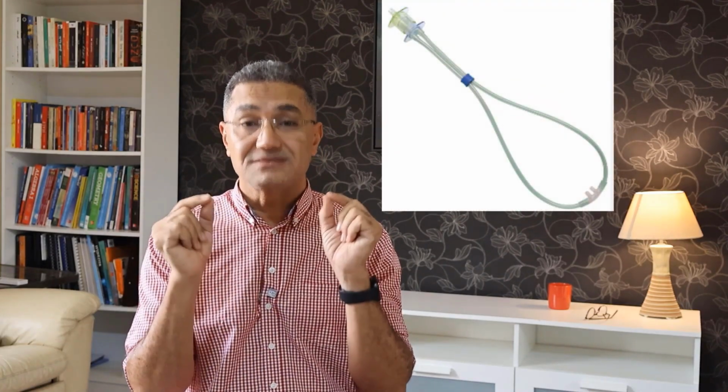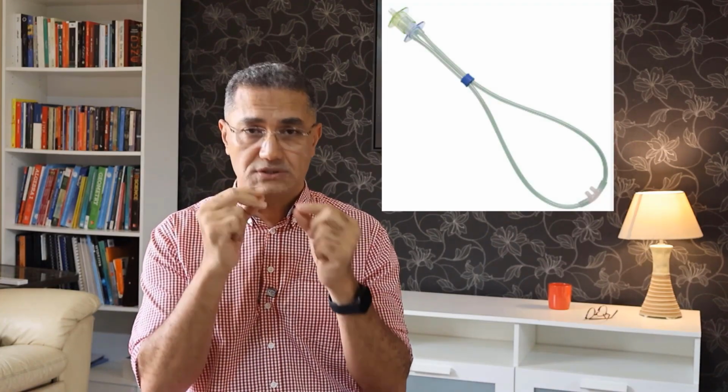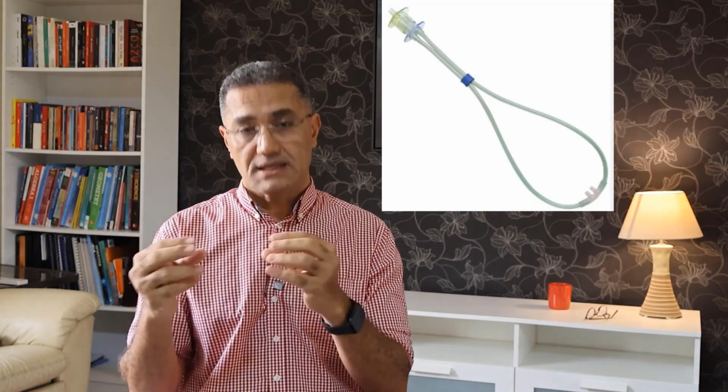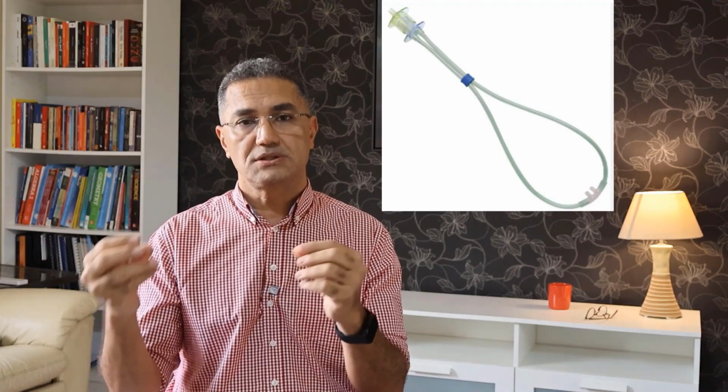One solution is to use a RAM cannula. It's important to clarify that when we say RAM, we're not talking about computer memory, but rather a specific type of nasal cannula. The RAM cannula looks similar to the regular nasal cannula that many people are familiar with, but it's designed to be used in a different way. The main idea is to connect the RAM cannula to the system that delivers respiratory support, allowing us to provide the necessary assistance to the patient without the need for a bulky, uncomfortable mask. This approach can make a significant difference for patients who have trouble tolerating masks, offering them a more comfortable and effective way to receive the care they need.